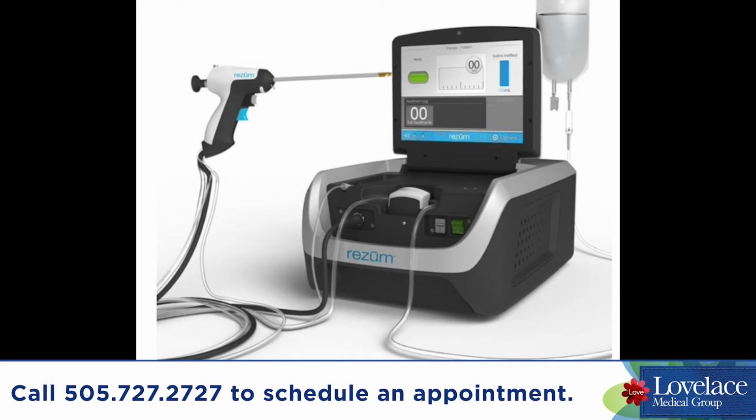Once the tip of the device is within the prostate, a small needle can be deployed into the prostatic tissue. A treatment cycle is begun, and it takes 9 seconds to go through its treatment. Multiple treatments can be completed during one operative session. The typical prostate usually takes between 2 to 4 treatments to treat the tissue effectively. Therefore, a trip into the operating room is actually shorter than the Urolift procedure using the Rezum.